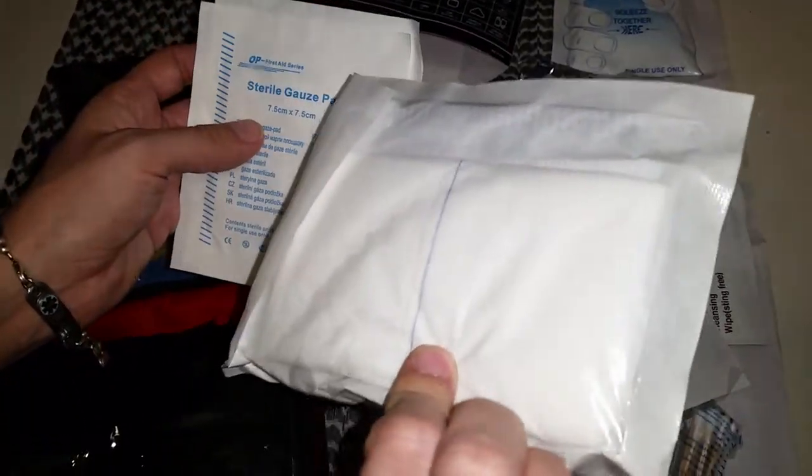Small bandage — if you have a blister you can use that. Some sterile gauze pads. An abdominal pad — some nice big ones, these are really absorbent.